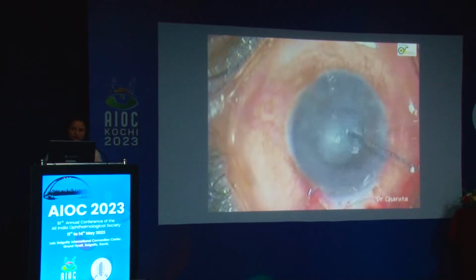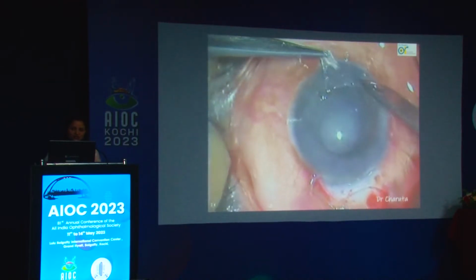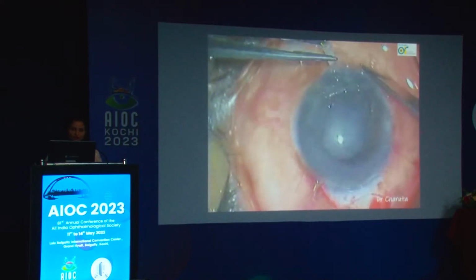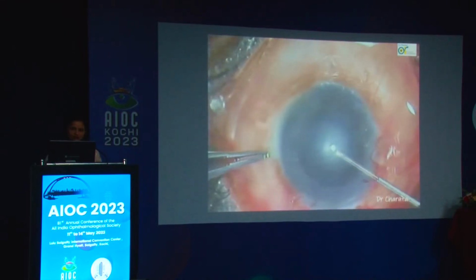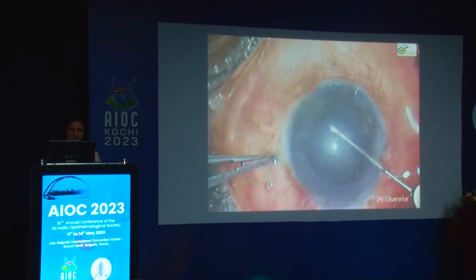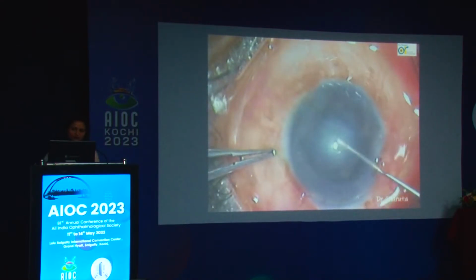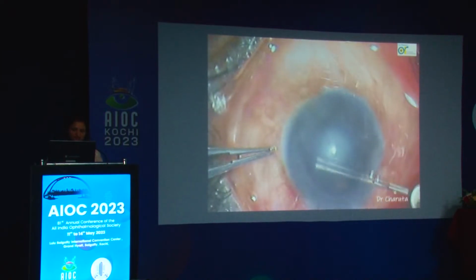During the preparation, topical paracaine was also instilled inadvertently, although I prefer in all these cases to operate only under peribulbar block. Therefore, while inserting the speculum, the epithelium had become loose and had to be removed. However, it must be noted that we must preserve the epithelium as much as possible in these cases.